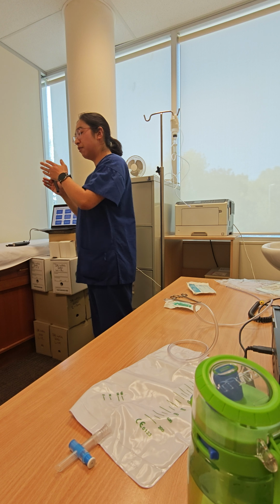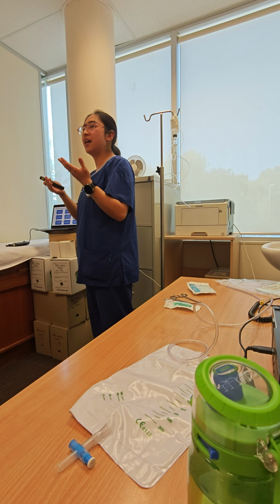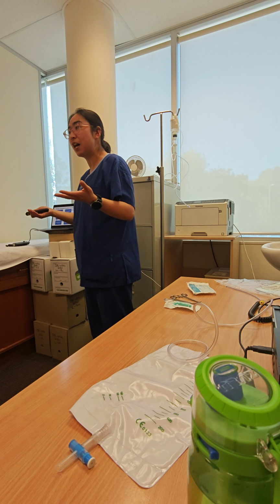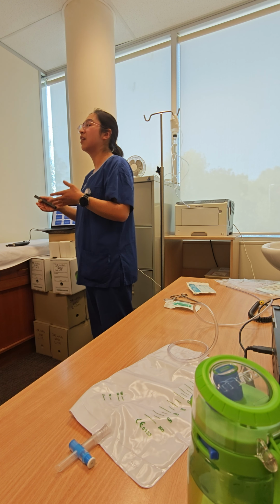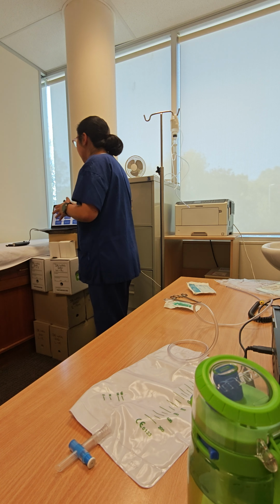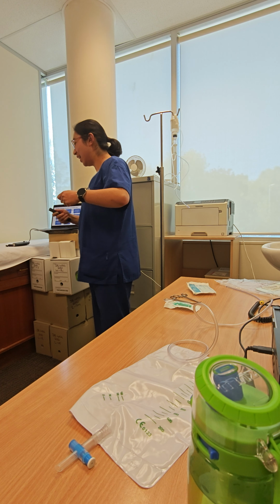But for the second, third, and fourth time, besides the referral, we still have the previous cystogram pictures and report to have a look at, as another referral. What happened for this patient? Why did he come back again, three times, or even four times? By reading all the reports and images, we're going to figure out the reason he comes back again to check for any leak. Is there any leak this time? Good, everything is done. We just wait until we reach the appointment time. Patient is here. We go out and bring the patient in.